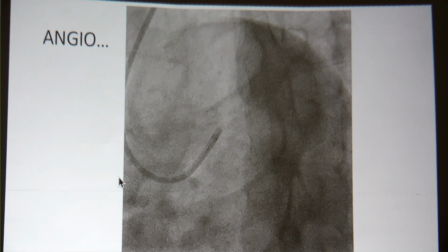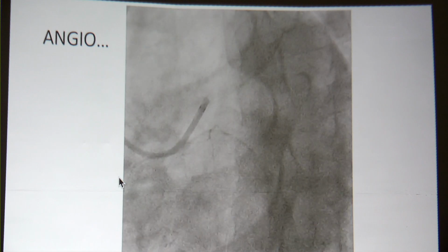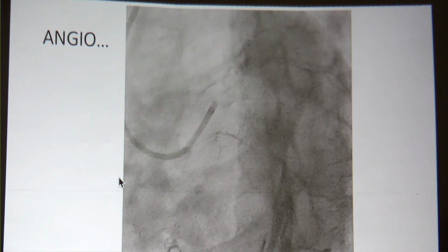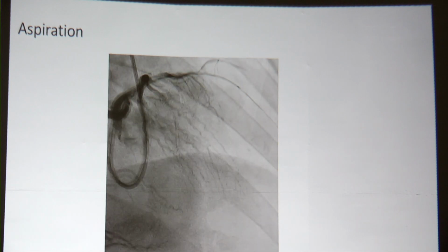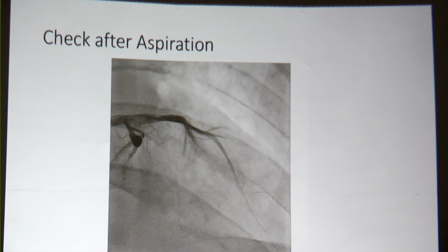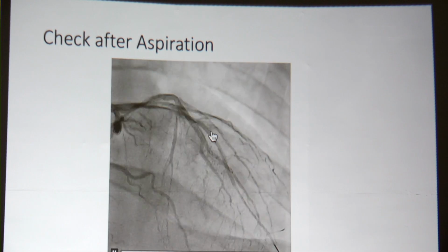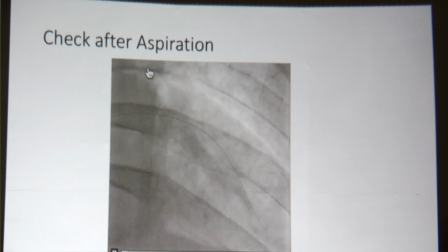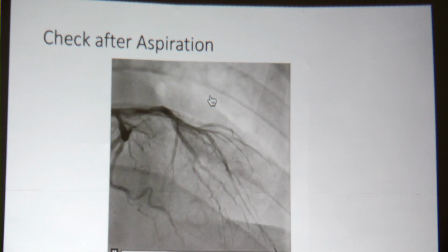And this is another common scenario in an anterior wall MI. He had an anterior wall MI like this, so you do a thrombosuction again. And when you do an angio, many times you will get a lesion, a very diffuse disease here, and probably an associated spasm. And then you don't know where to put a stent. Should I put it in the proximal segment or distal?